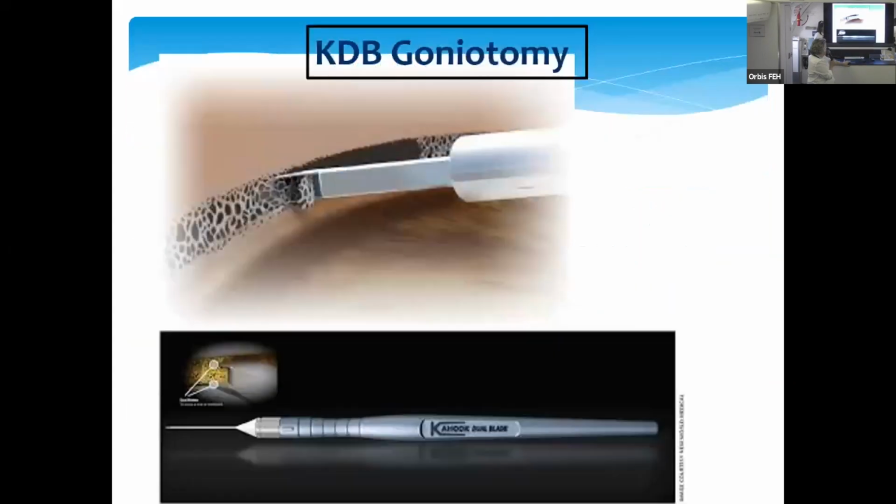Just go back here a minute. One thing about these procedures, they seem to get more steroid response than, say, if you put an iStent in or you put in a Hydrus, and I think that's because we've just done so much roofing and the steroids get in there. So you don't really know if they worked for about a month, as you taper the patient off the steroids. And if it's a 20/20 eye, they're about 20/30 blurry the next day. They've got some red blood cells floating around and they seem to disappear pretty quick.